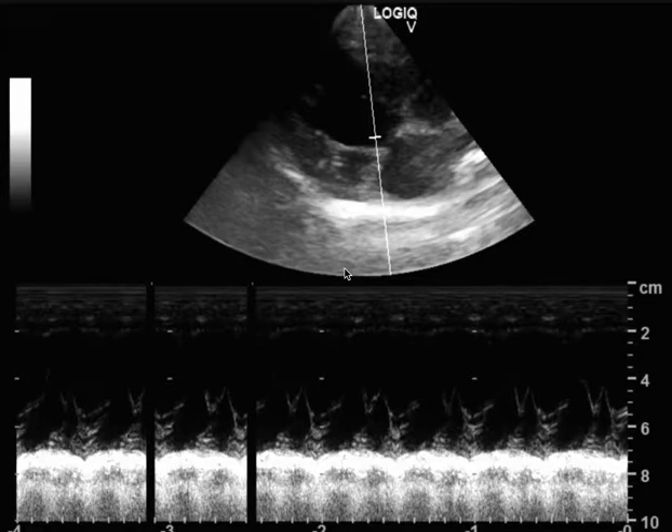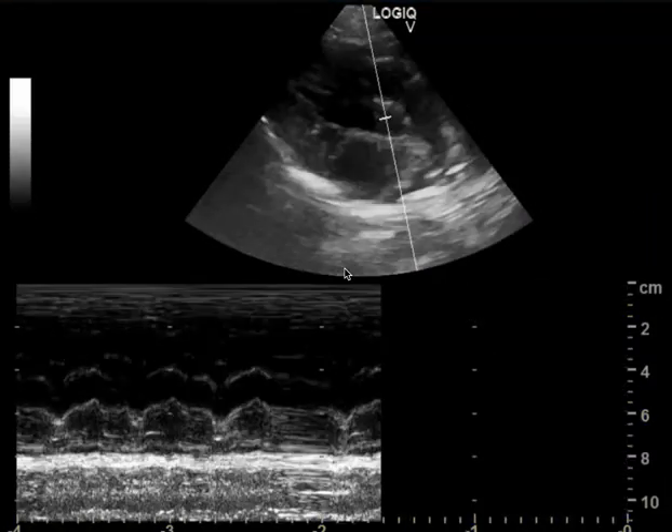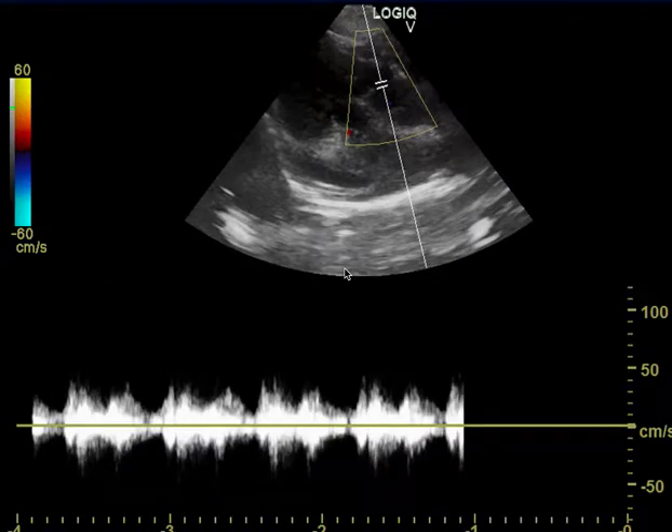Good morning. On this dog we have a not bad echo — good solid start. Nice positioning for the tricuspid valve, nice E wave and A wave, no regurgitation. Remember that tricuspid valve regurgitation can be very small and most of the time it comes in this direction. So if you're placing the gate just prior to the tricuspid valve in the right atrium, more towards the septum, you'll pick up small jets a lot easier.